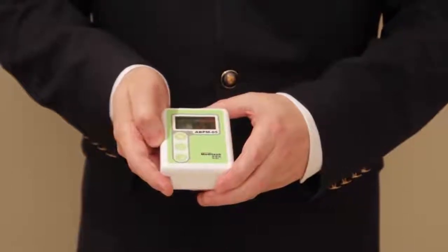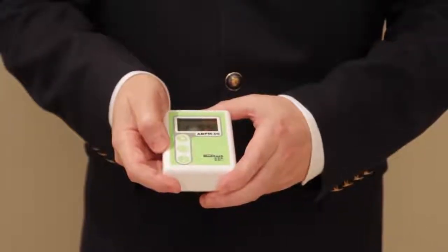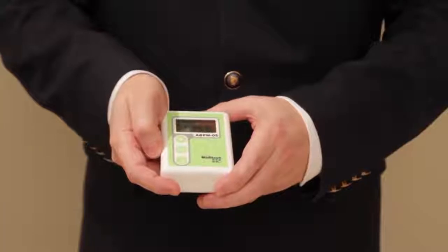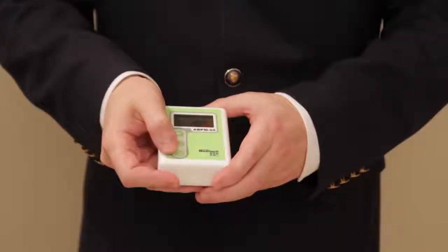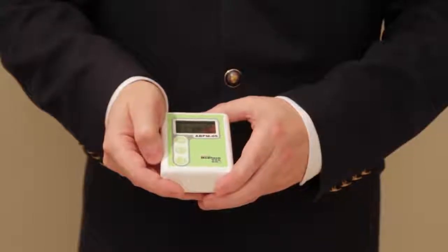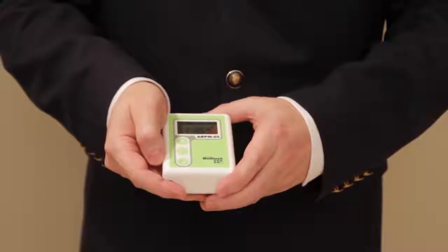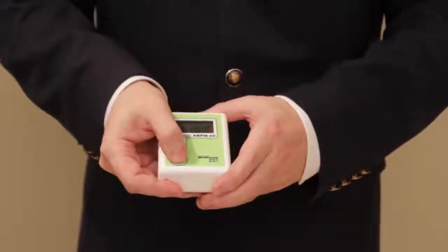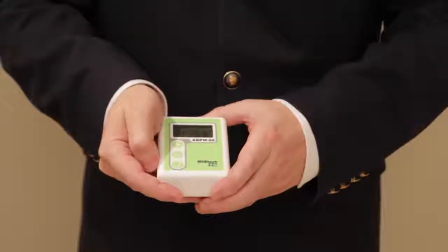They will execute correctly. If you want to press the event marker button to set an event, the LCD will show it with 2 dashes, which is displayed just for a short time. If you want to switch the device to night mode, the crescent moon will show that the device is now in night mode, if so programmed. To cancel night mode, you press the same button once again, and one beep is audible.